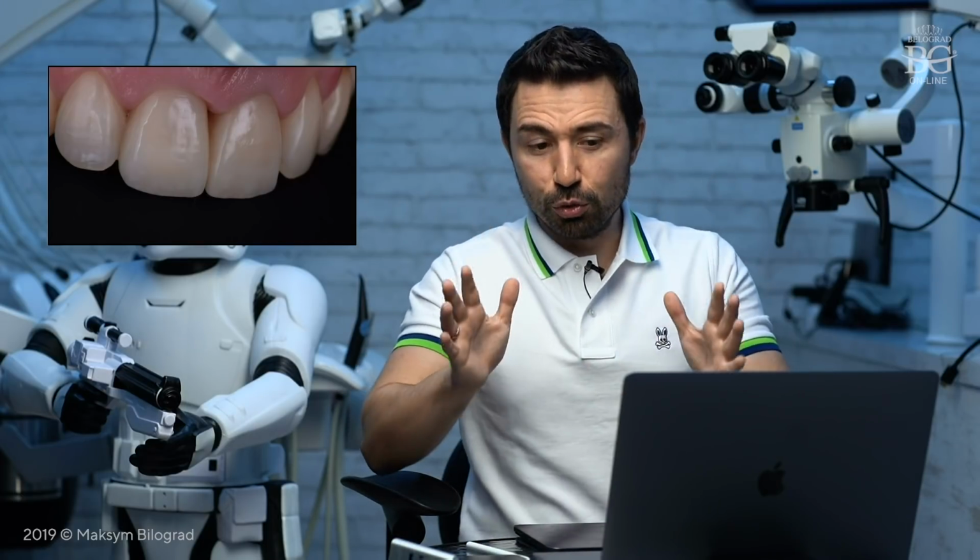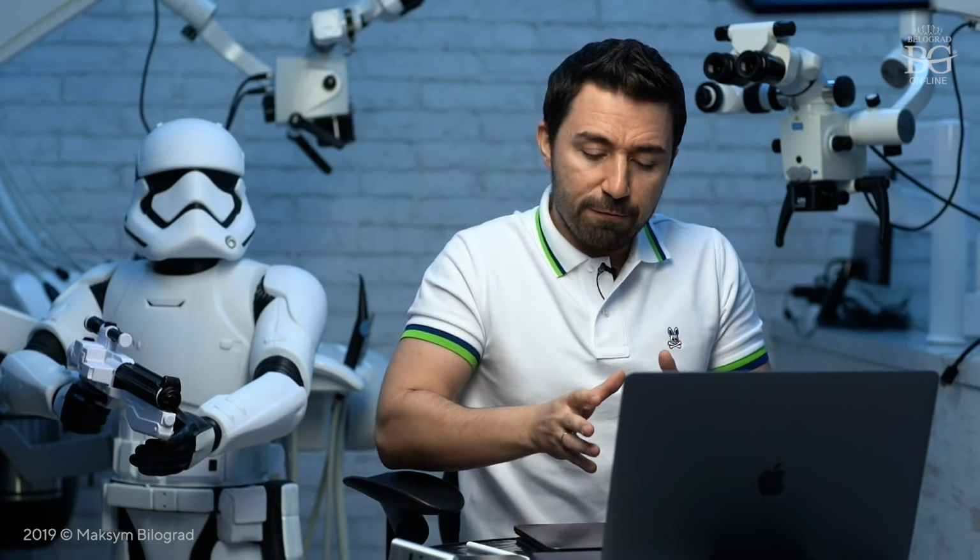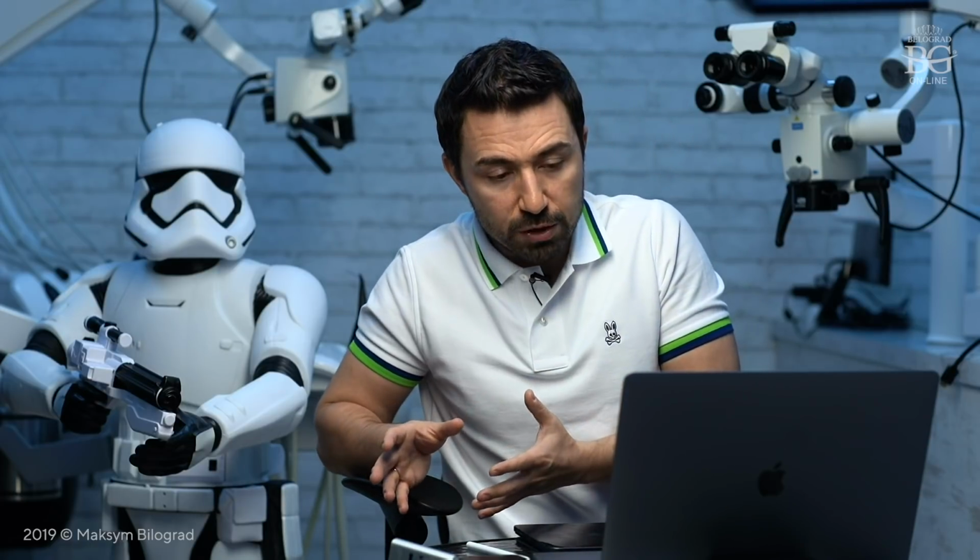We are done. Conclusions. In this case, if you go into a compromise approach, you have to do the best option, not the best options, because the best option maybe was orthodontic treatment or crown lengthening. But I mean, if you do a compromise type of treatment, the steps of your compromise treatment have to be perfectly done. Preparation, perfectly done. Temporary crowns, perfectly fitted. Final results, super precise. In this case, you may expect a nice result, biologically and aesthetically driven.